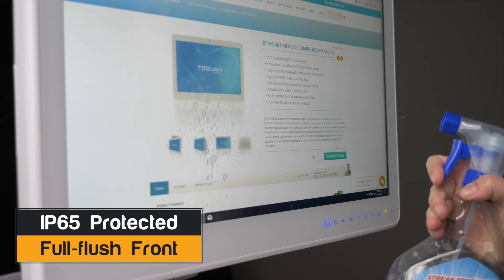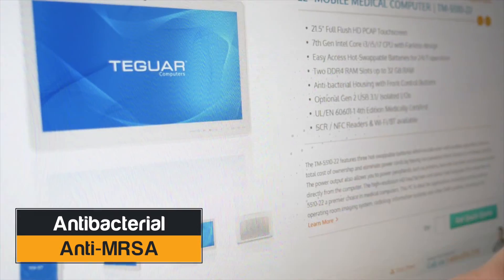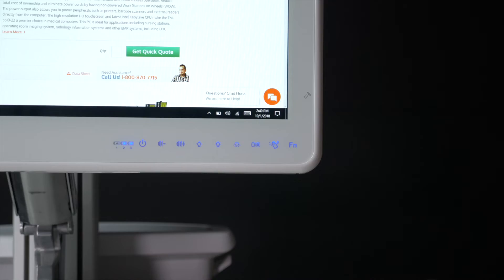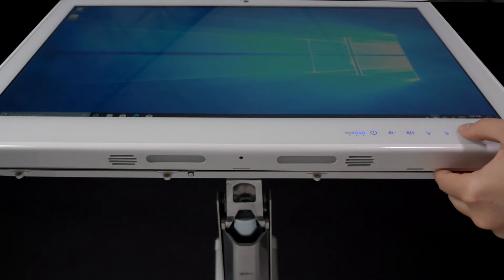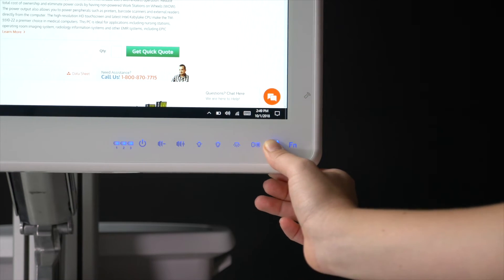This PC has an IP65-rated fully flush front with an antibacterial enclosure. Located on the front are control buttons that control power, volume, brightness, display, reading light, and a screen lock so you can wipe down the computer without affecting the touchscreen.